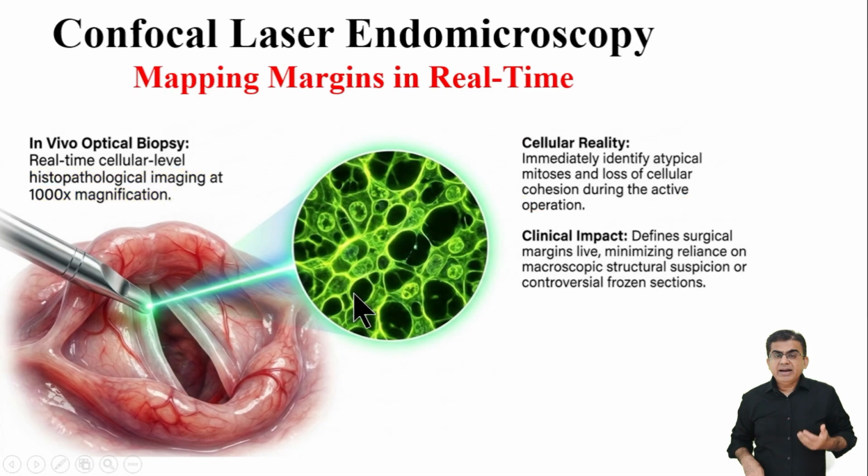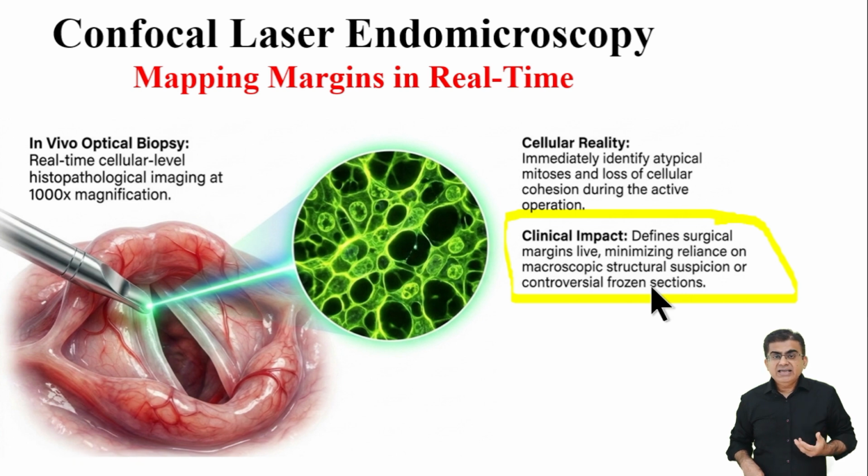What is the clinical impact of this? As we discussed in the last segment of our lecture, standard frozen sections are highly controversial and often unreliable because of the laser's thermal artifact. This advanced technology safely overcomes this major limitation. We actively use this probe to map the exact microscopic borders of the tumor before we even start cutting.